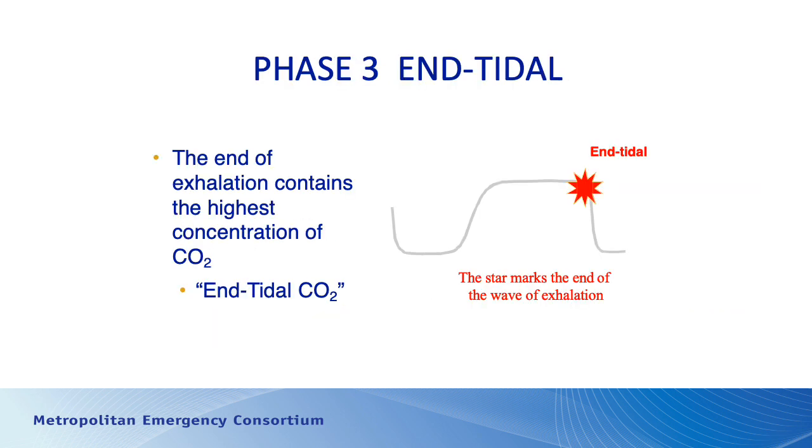If you look at the end of the plateau phase, that's what we call the end tidal CO2. So that's just before you start inspiring. That's the end tidal CO2, and that's what we're talking about, that phase of the curve as patients are exhaling, when we say, what's the end tidal CO2 value? So when you have a device that's just giving you a CO2 value, it's the end tidal value, at that end of the plateau just before the patient starts inspiring.